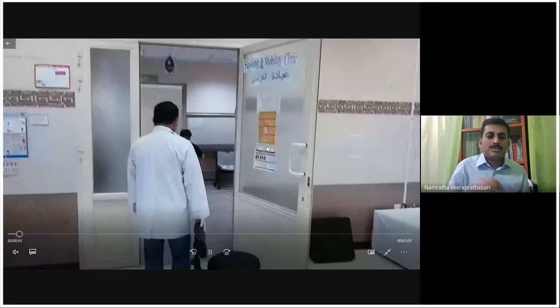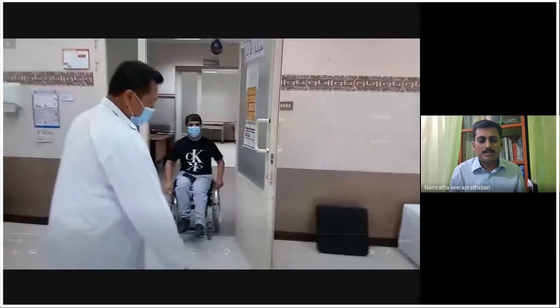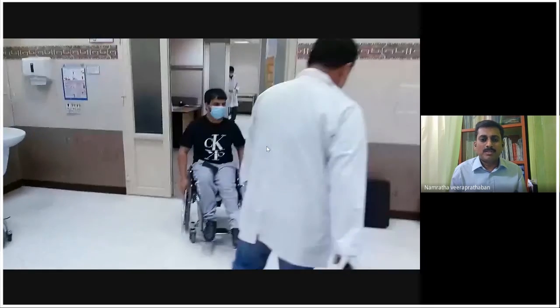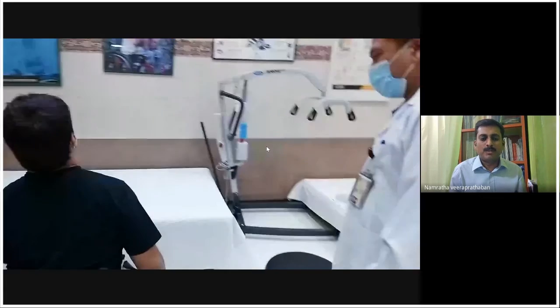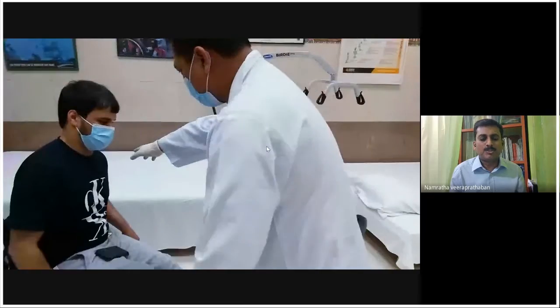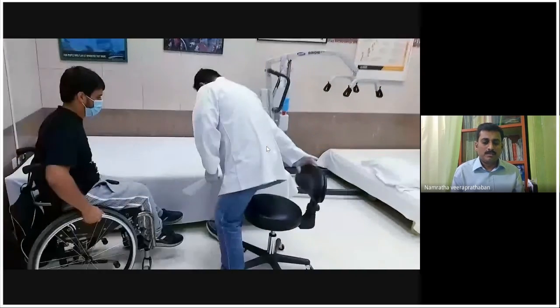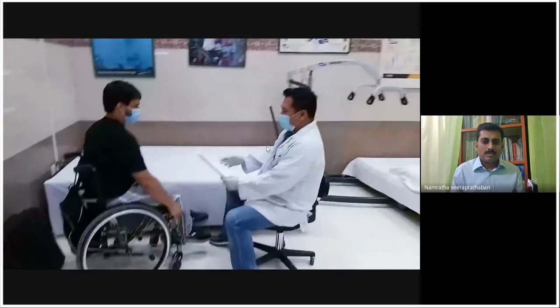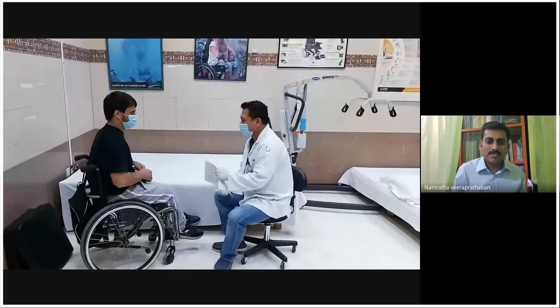All right. This is how our session actually started. Now he is coming in for an assessment. He's a CP diplegia. As I said, look at the posture, how he is in the wheelchair. Just observe his pelvic, his spine, his lower limbs, his knee flexion, observe everything. Now he's going through the interview process. I cannot show you the whole interview process because of the time limits.